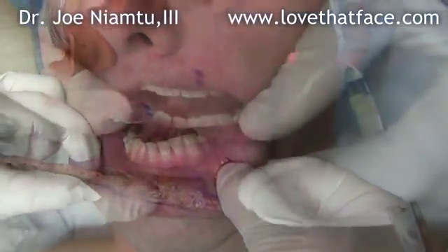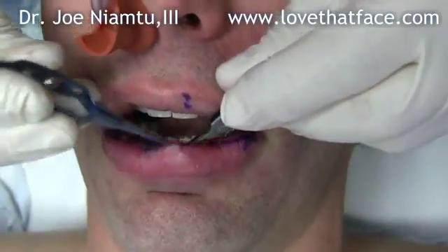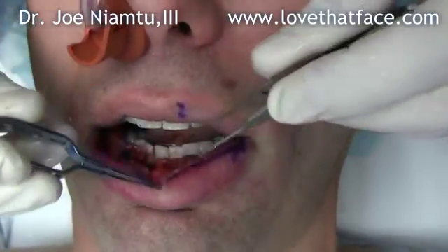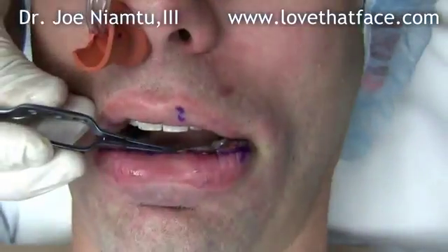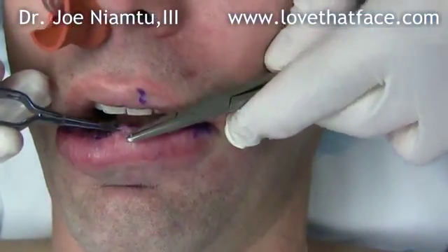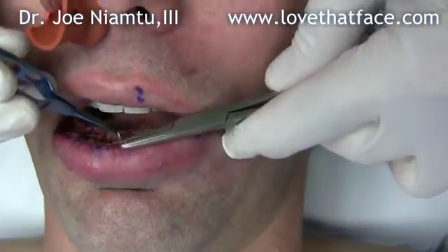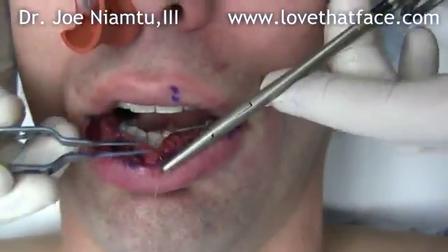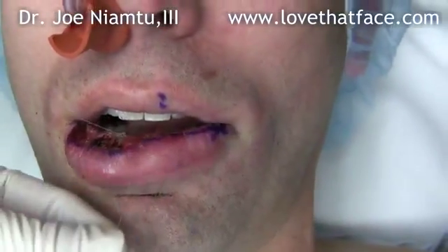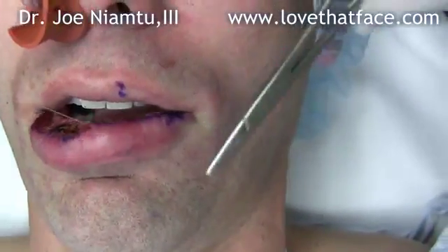There's just zero bleeding and we've trimmed some of the salivary glands. The whole purpose of this is so the incision closes and the suture line will be on the inside of the lip. We're going to put some 5-0 gut key sutures in. I like to close with sutures that have to be removed — I don't want to use dissolvable sutures for my final closure because they have a tendency to come out. I like to use a 6-0 silk suture and leave that in for about nine days.